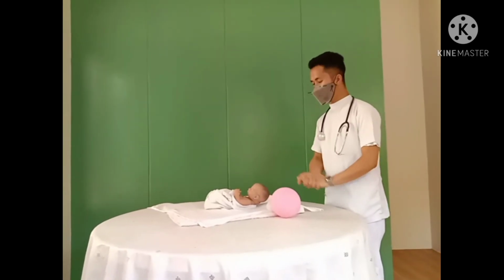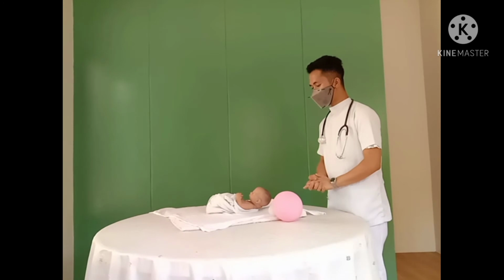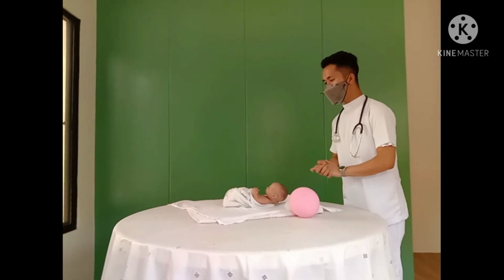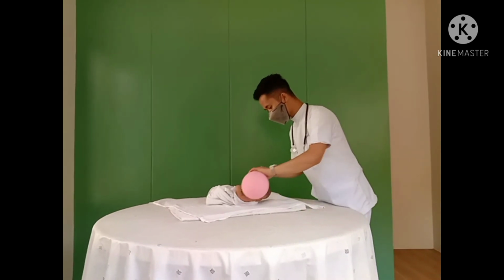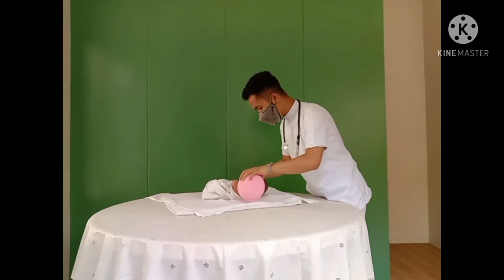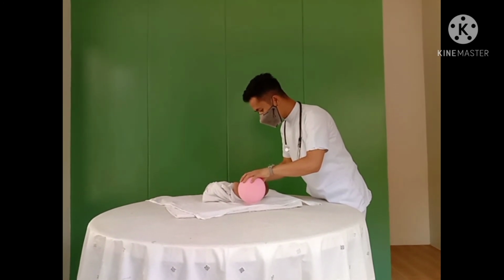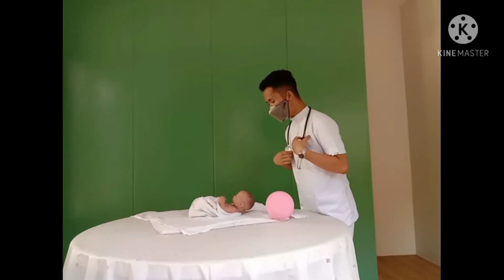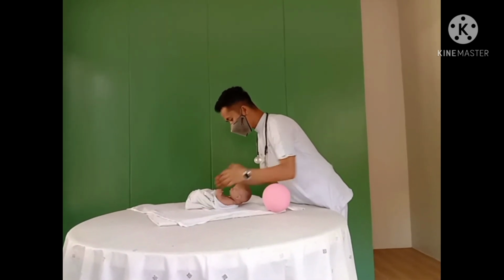After reassessing, the baby has no response, the heartbeat is still low, and the color has not changed, still cyanotic. So we should perform the ventilation again, 5 times. One, two, three. Two, two, three. Three, two, three. Four, two, three. Five, two, three. Then check if there are changes in the heart rate and the color.